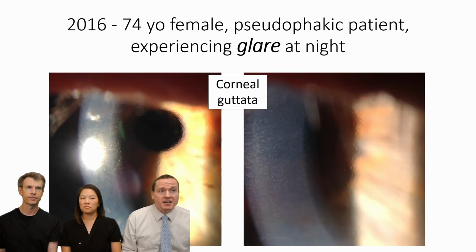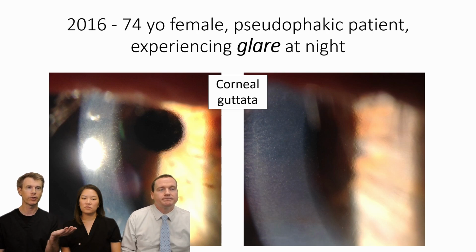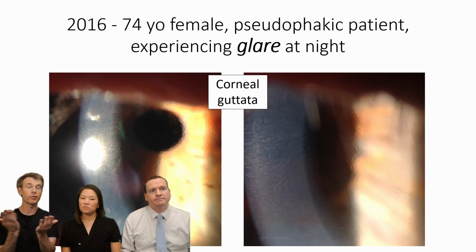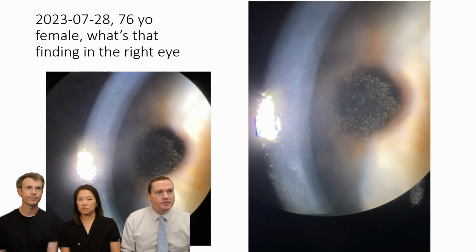This is an example. I had a patient, she was pseudophakic, said, I'm getting glare at nighttime, and I couldn't blame a cataract because she was already pseudophakic. And I look, and I really love the retroillumination coming off the iris, and you can see those little bumps. I used to think of them as dimples, but they're really protrusions back into the anterior chamber. Each of those guttae are protrusions backwards, excrescences, and yes, both cataract and cornea can affect the vision. Sometimes it's bad enough we do both at the same time. If a patient is uncertain or we're uncertain, let's do one thing first, cataract, and then see, we can always do a transplant later.